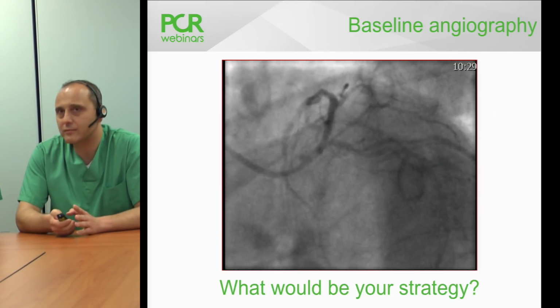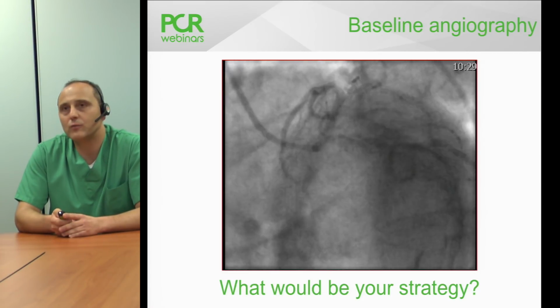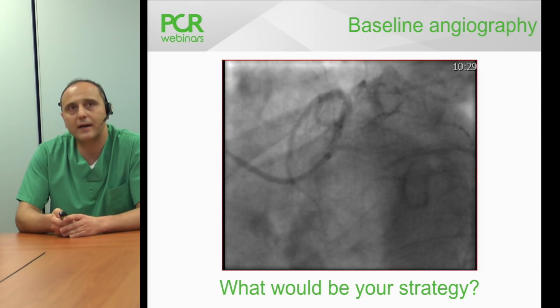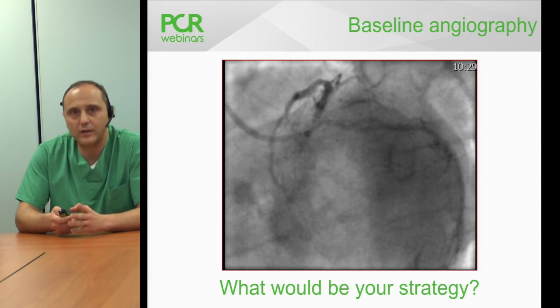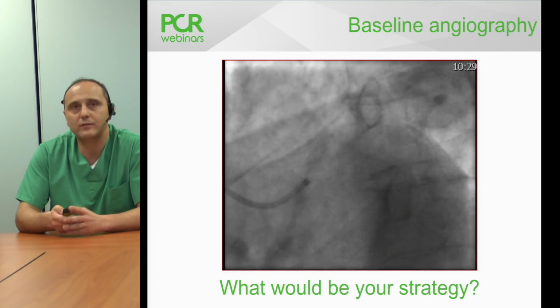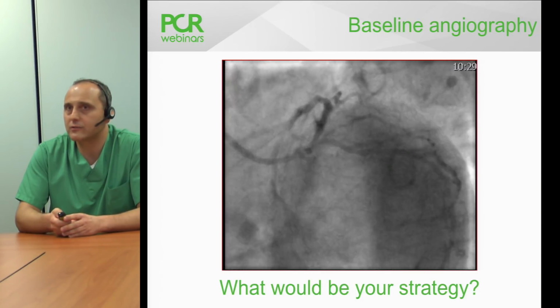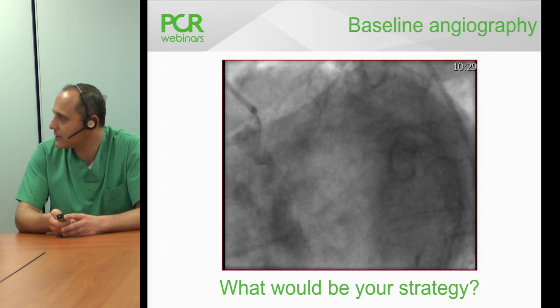Okay, then next question, but before posing the question to you, let me ask the colleagues, would invasive functional assessment be your first choice in terms of additional diagnostic assessment? Please push on agree if you agree from home that we should do invasive functional assessment to obtain more information of this left main. And while I give the time to the colleagues to answer this question, we see the answer. What is your opinion about this?